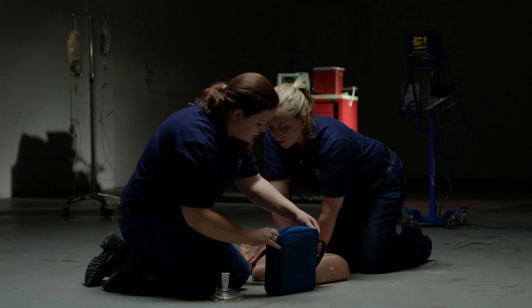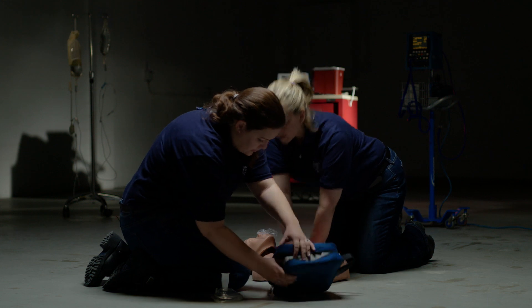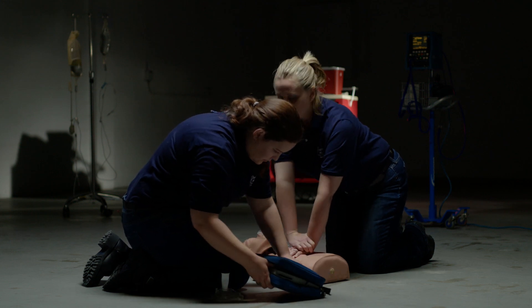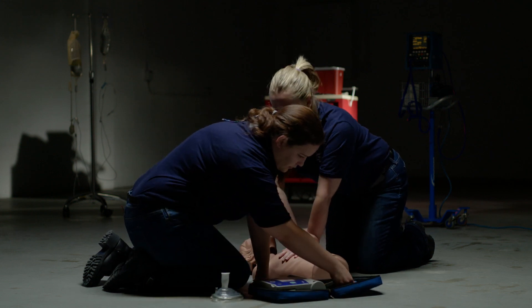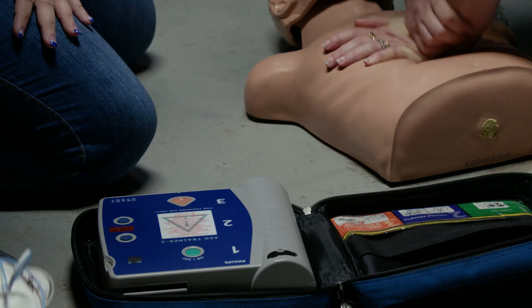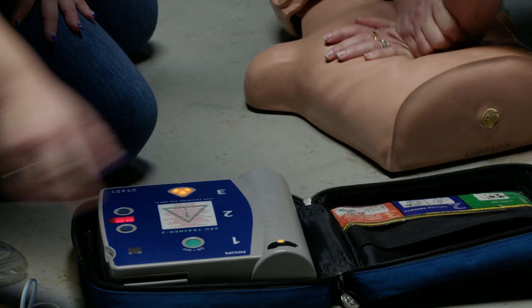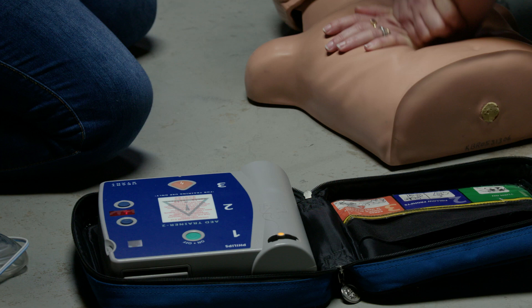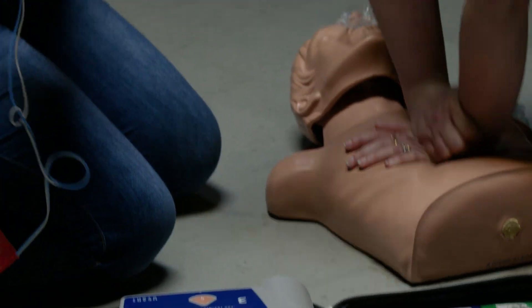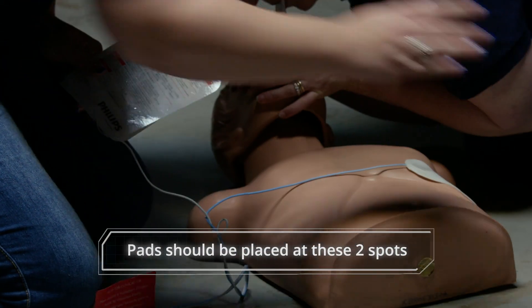One, two, three, four, five, six, seven, eight, nine, ten, 11, 12, 13, 14, 15, 16, 17, 18, 20, 21, 22, 23, 24, 25, 26, 27, 28, 29, 30. Apply pads to patient's bare chest.